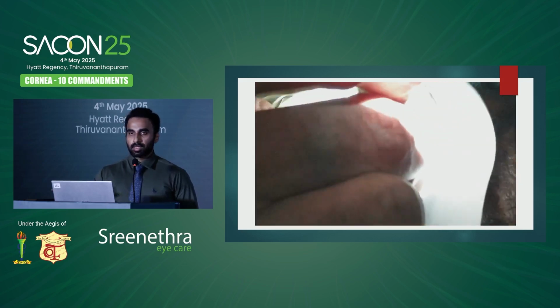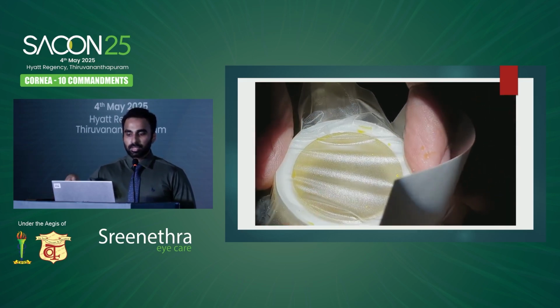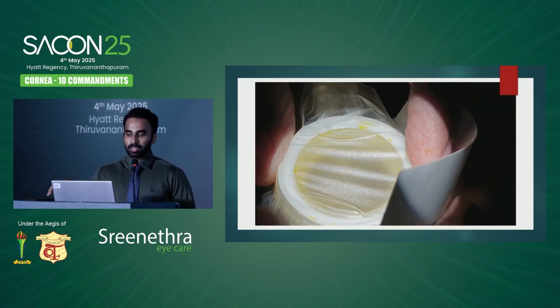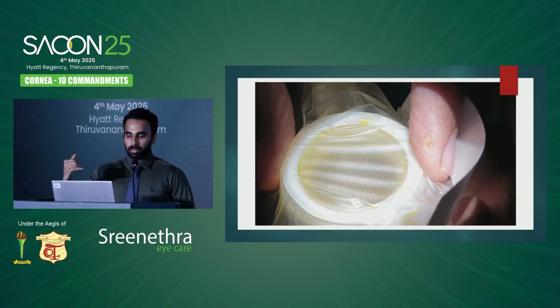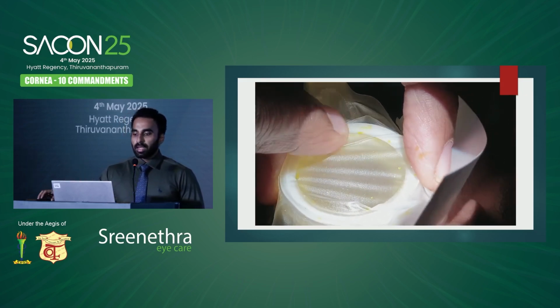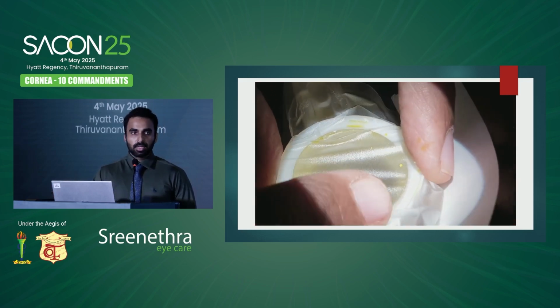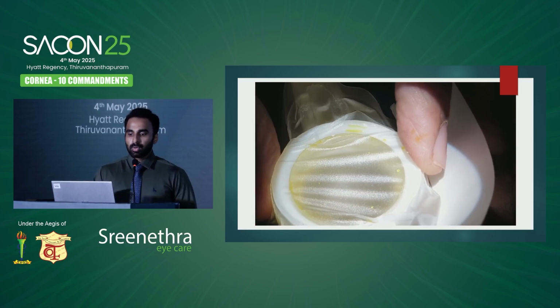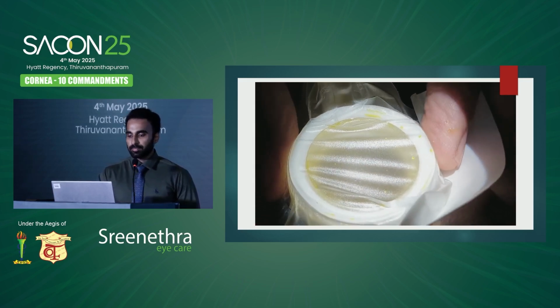So once you place a sterile drape, what you're doing here is you're increasing the pressure inside this chamber. As this pressure increases, you will find that the riboflavin is able to penetrate through that intact epithelium. Every 3 minutes, we keep replenishing the riboflavin as it's getting depleted inside the chamber, to ensure that this reaction is continuously occurring for 15 minutes at a time.